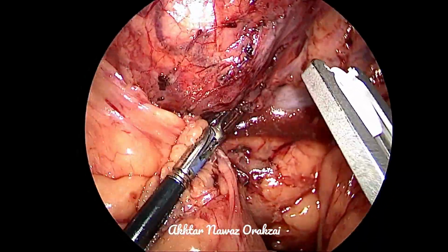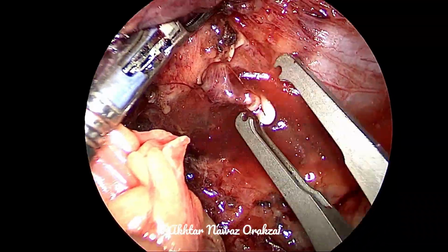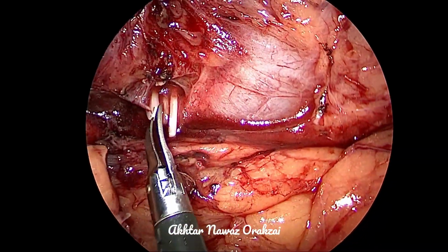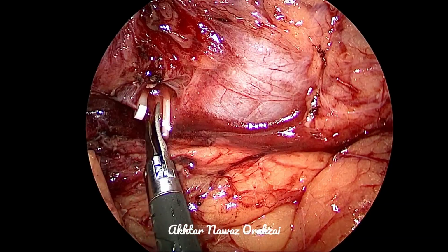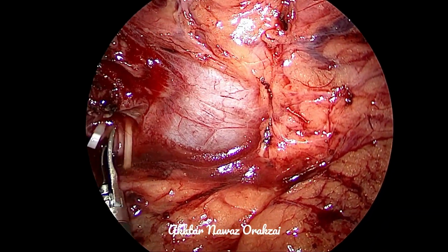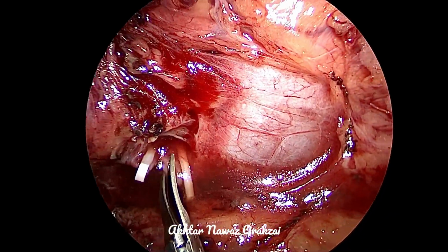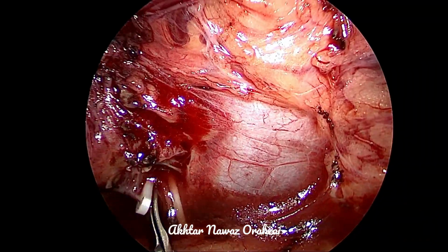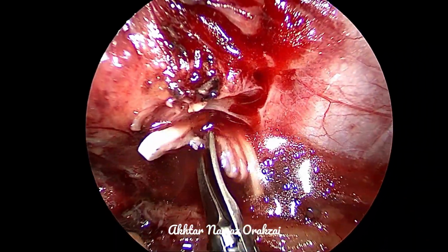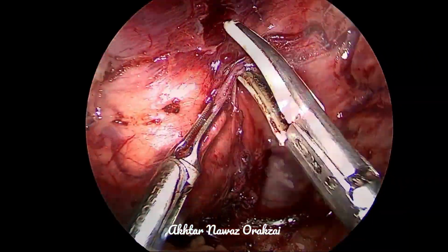So the adrenal vein is clipped, and then a bigger clip is applied towards the big vein, and another bigger clip is applied towards the adrenal gland, and then the adrenal vein is divided. You will see in a while that the moment this adrenal vein is clipped and divided, there is congestion of the adrenal gland and the small vessels around the adrenal gland.